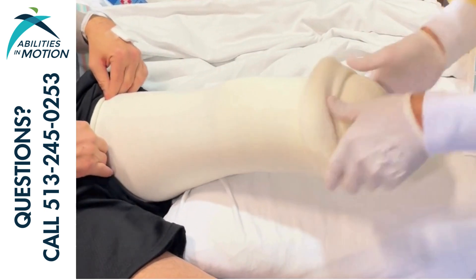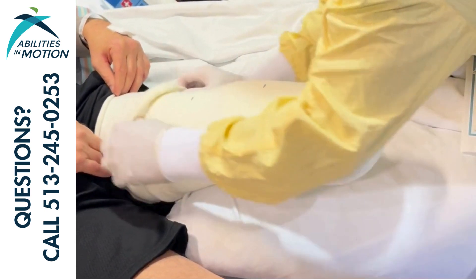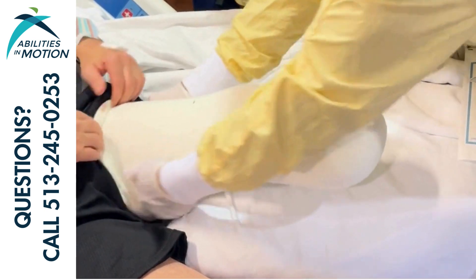Make sure that you are always reapplying the same number of socks as you found the patient in. The AIM staff has applied a certain number of socks on purpose to help cushion and pad the cast and make sure that it's maintaining the correct fit.